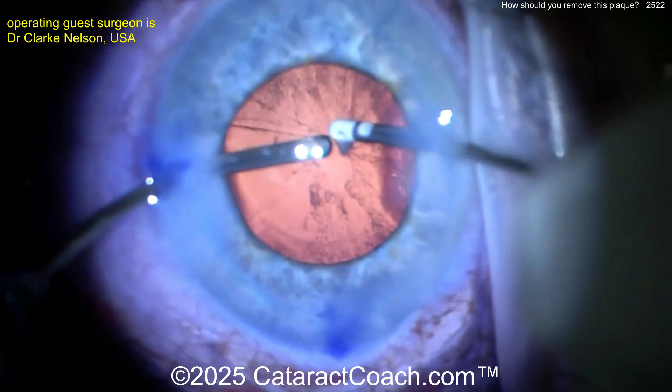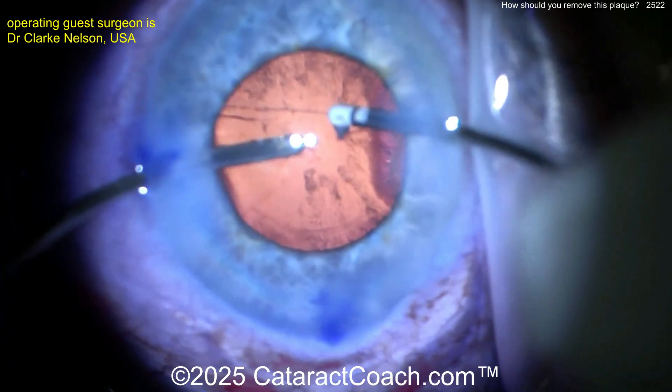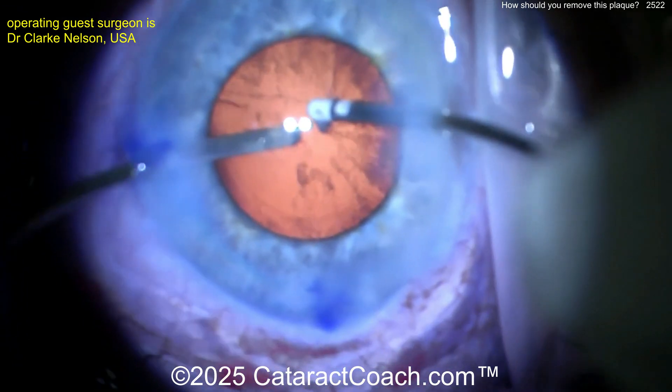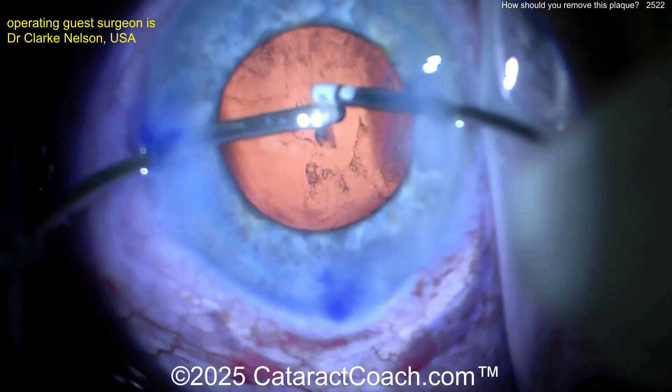Now could you just YAG it later? Of course. And after you saw the video from me a few weeks ago, where I did the same kind of situation and I just decided to leave it alone — I can just go back later and do a YAG capsulotomy. That's what we ended up doing for that patient, and the patient ends up being very happy.